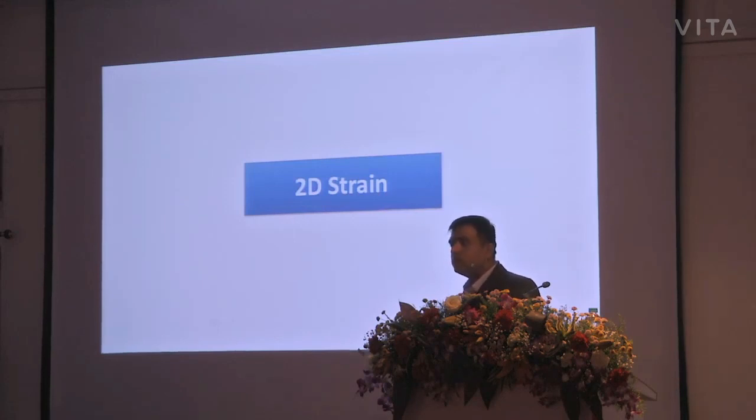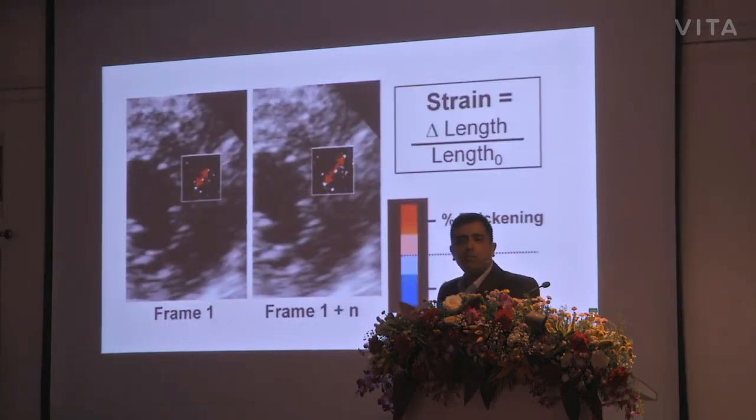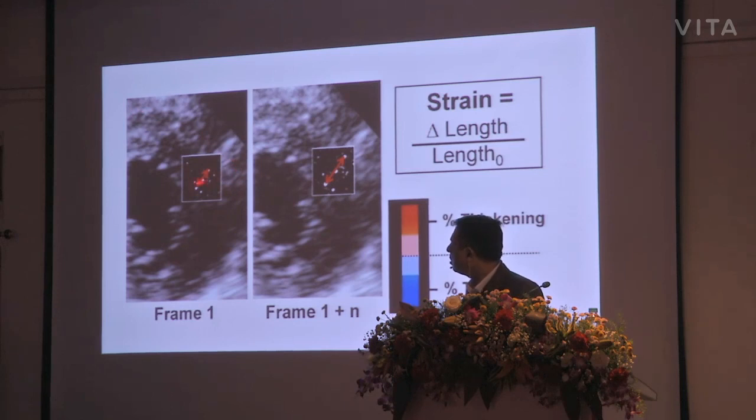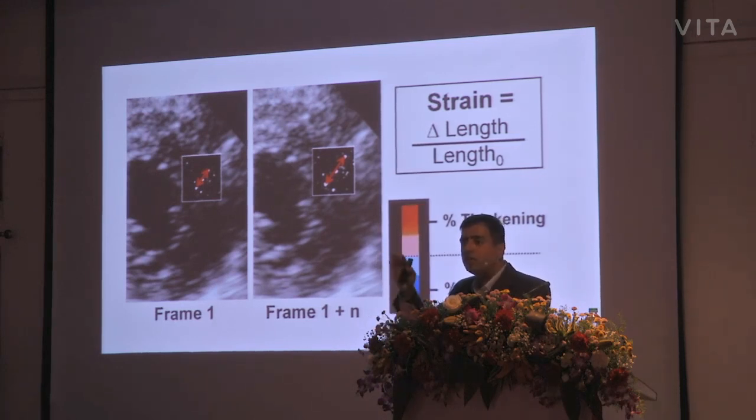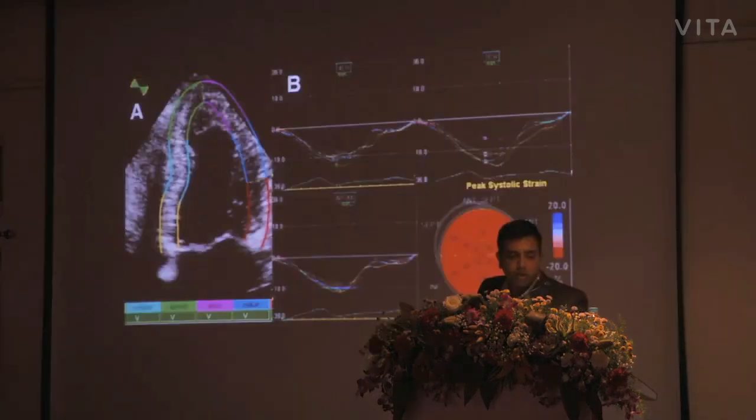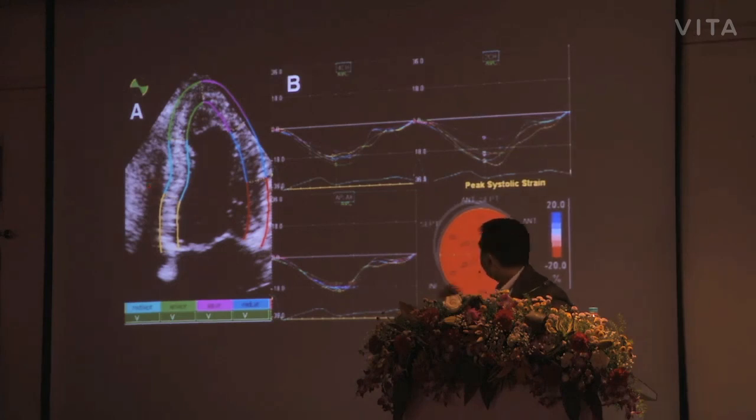So to overcome all of this, and this is a modality that you and I will be using in the future, you have speckle tracking or strain. There is no Doppler involved in it. Okay. There is a good 2D image, and what they do is these white speckles, as they are called, the computer marks these speckles and sees where the speckle has moved from one frame to another. And hence, it knows the displacement or how much the speckle has moved, and it can calculate strain directly without any Doppler, without time, velocity, nothing. So the future of tissue Doppler imaging will be speckle-based imaging, and you will get an automatic strain and strain curve like this, like some of the machines that we will show you here.